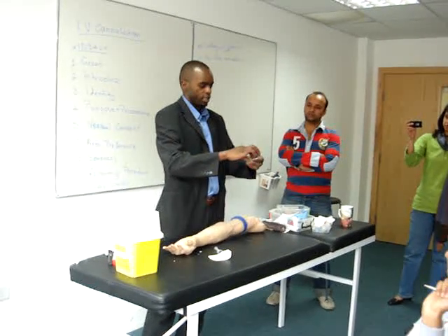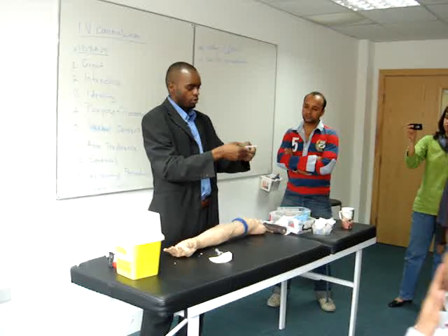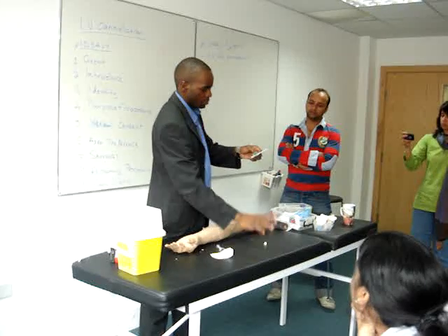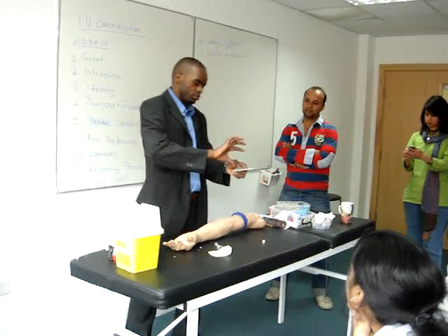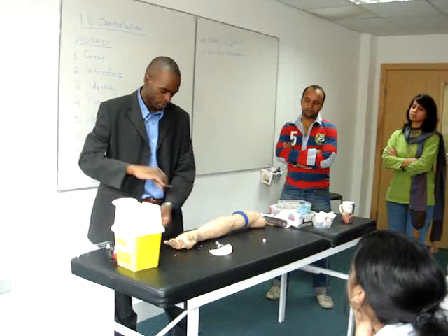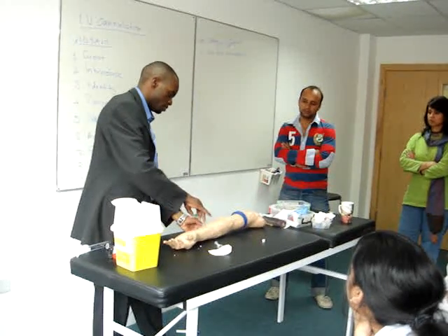Take the cannula, open the wings. Remove this. Upside down. Hold it there. Remove the OSB. Stretch the skin back.